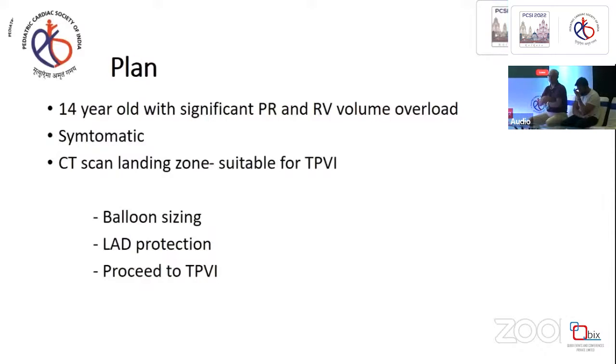Left femoral artery is for coronary cannulation, and the other one, left femoral vein, is for your right ventricle injection, for looking for the sealing of the RV when we have balloon dilatation. Can you show the first angio, please, fluoro? Can you go to first fluoro?